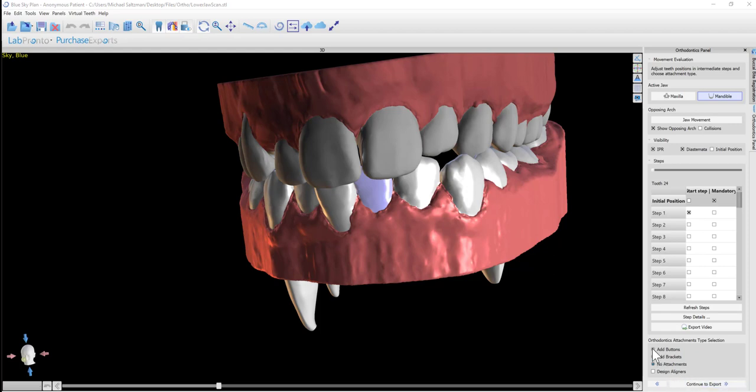We have other options as well. We have the option of add buttons. If you want to add buttons to increase the strength of the connection between the liner and the model or with the teeth, then you would click add buttons, and we'll take a look at that in just a minute. We also have add brackets in a situation where you're going to be creating an indirect bonding tray. If you're going to be creating an IBT, then you would use the add brackets option.